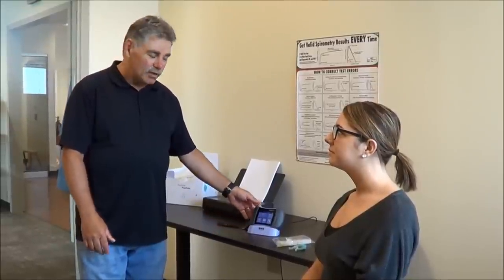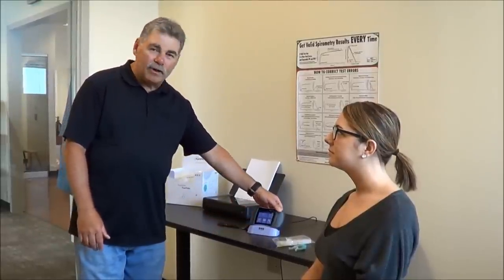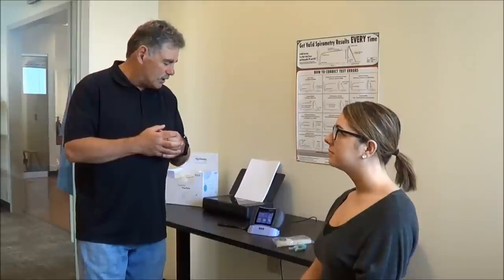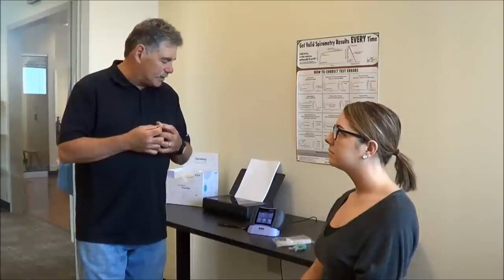So today we're going to do spirometry on the EasyOne Air spirometer. In spirometry, the coaching of the patient is very important, and the maneuver requires three acceptable tests to be done. There are three components that need to be done correctly.